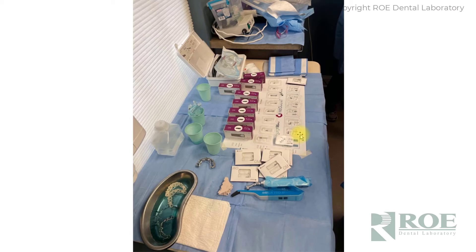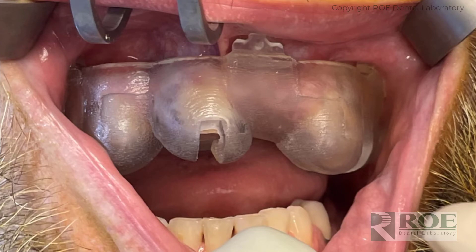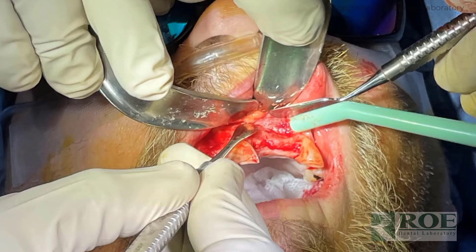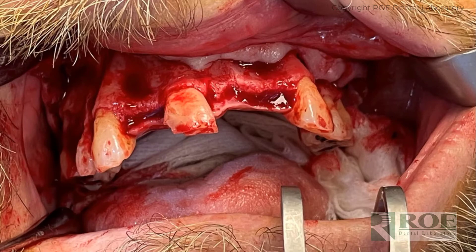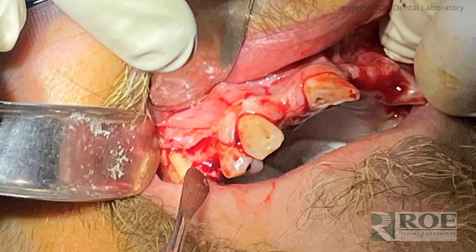Parts are soaking and well organized. This doctor restores a lot of Chrome cases — sometimes two or three arches in a day — so it has to be organized and well planned. The pin guide is tried in first. Sometimes it's uncomfortable for the patient, so you anesthetize first, try the pin guide in, and make sure there's no rock. Then the tissue is flapped: lay the tissue back on the labial up to the point just beyond the fixation base. It can be an aggressive flap on the labial, as with all full-arch guides.